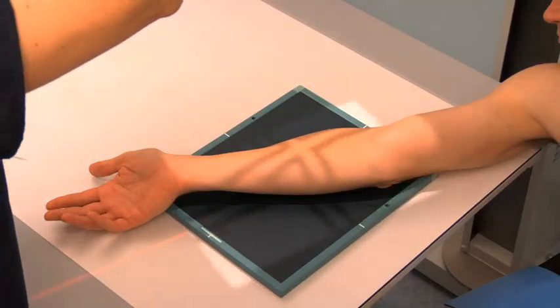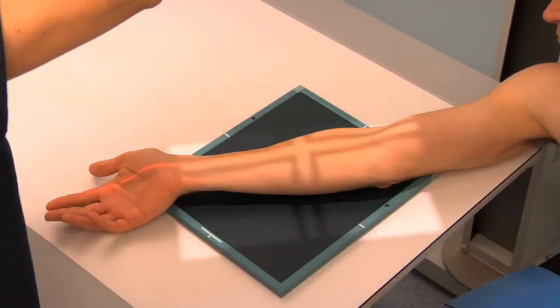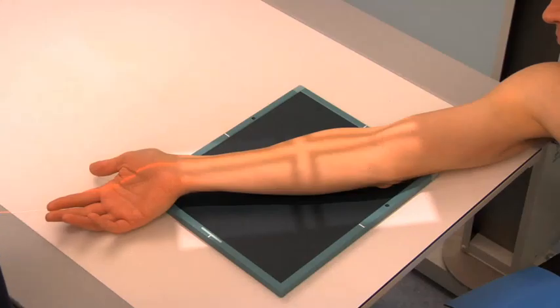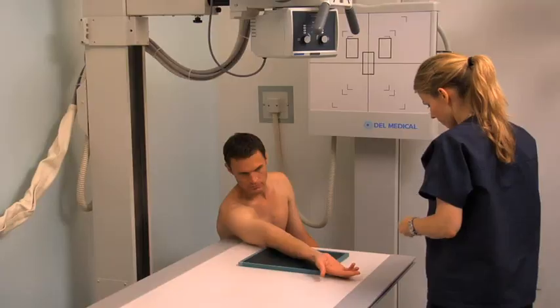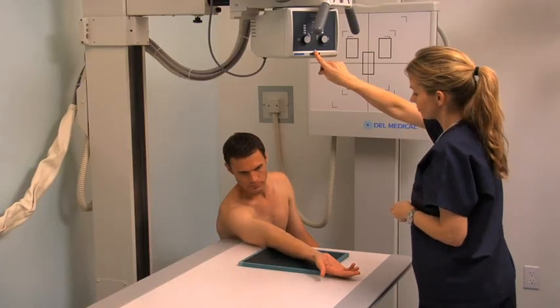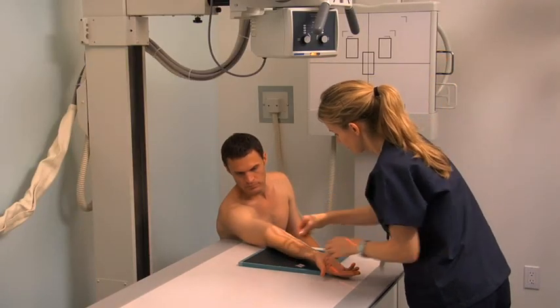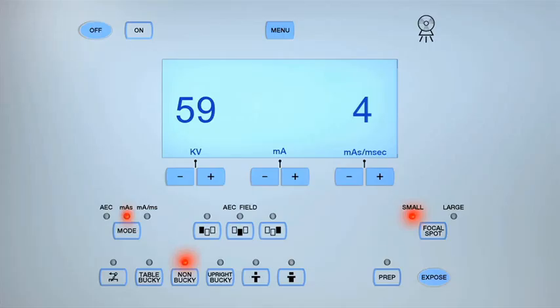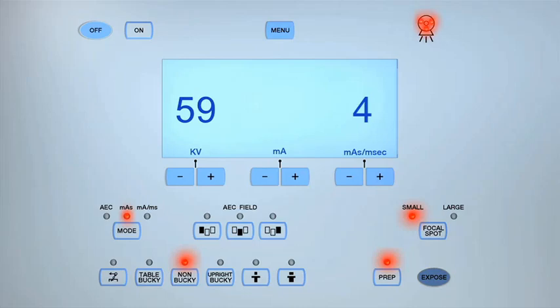Center the central ray to the mid forearm and between the wrist and elbow joints. Collimate the light field to include both the wrist and elbow and the sides of the forearm. Place the appropriate lead marker within the collimation field. Move behind the lead barrier and adjust the exposure settings if necessary. Expose and process the cassette.